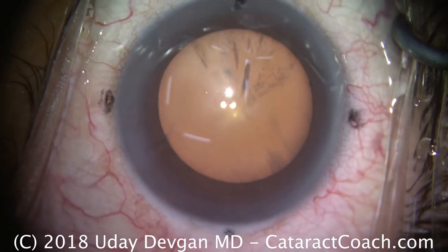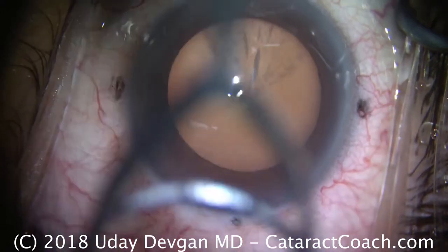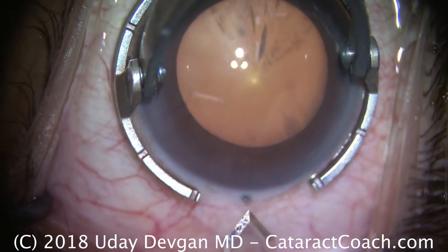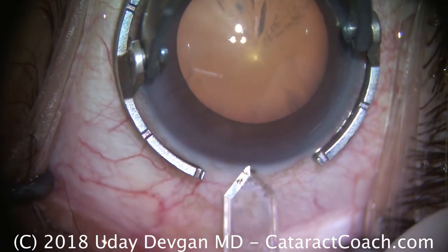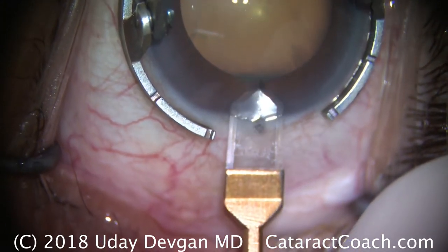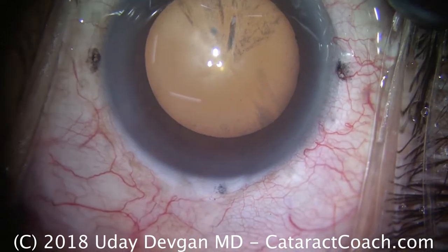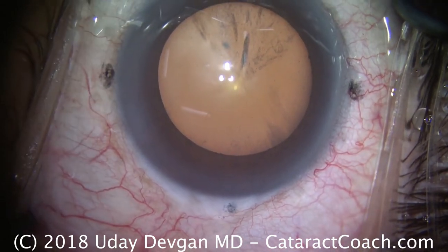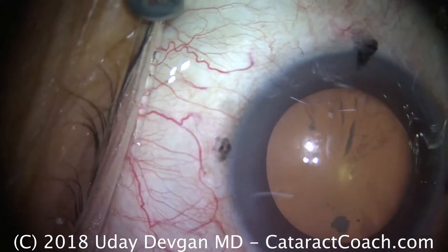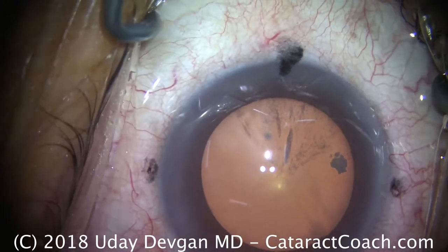The dots on the cornea are at the cardinal meridians — 12, 6, 3, and 9 o'clock — to mark the with-the-rule and against-the-rule axes. Here's the diamond keratome being used to make a temporal incision right at the 180-degree axis. It's a single-plane incision of about 2.75mm, and the reason is it's going to help reduce the astigmatism. This patient has about a diopter of astigmatism against the rule, steep at 180, so by placing this phaco incision on that steep axis, it helps.